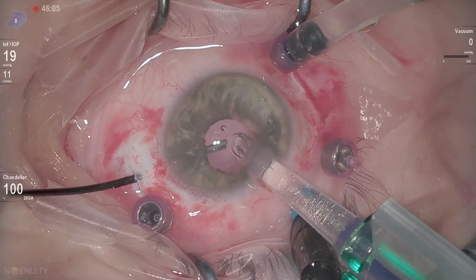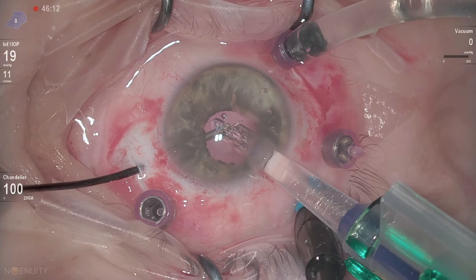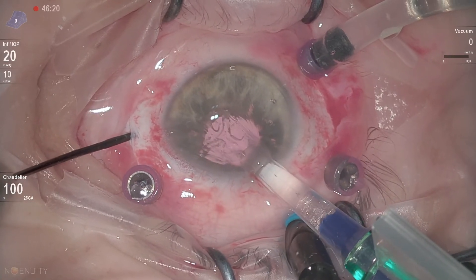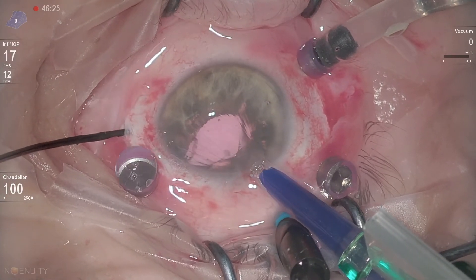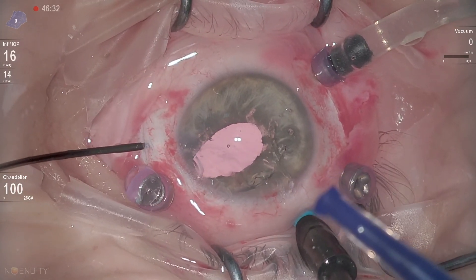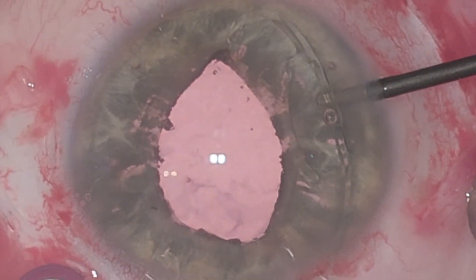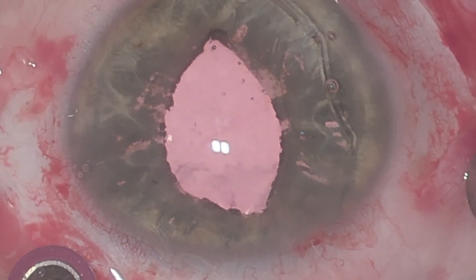Of course it will be placed under horizontal scleral pockets. In my opinion it is good to be inside the eye, so the incision is not 2.2 but around 2.4 mm. Now I will place the leading anchor under the scleral flap. And what happens here? I found out that I amputated with the cartridge or the plunger the trailing anchor. So — do I remove this IOL? How do I fix this IOL?